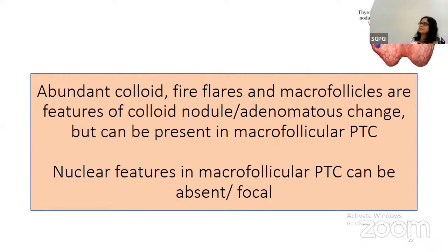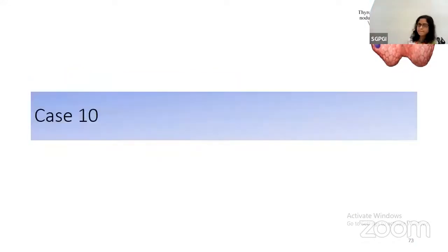When I came across these cases, I was taken aback, especially the first case. The first case had lymph node metastasis, and I was actually taken aback. That's when I went back and saw the smears again. Subsequently, 2 more cases came within the next few months. So that's how I started collecting them and noticing these cases.